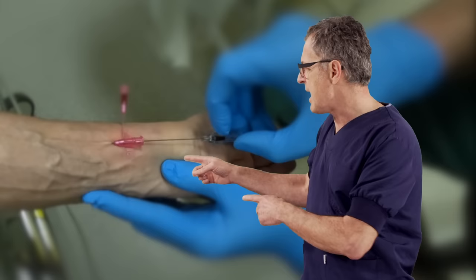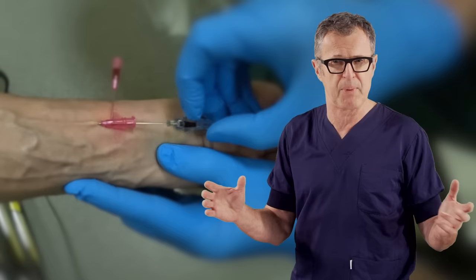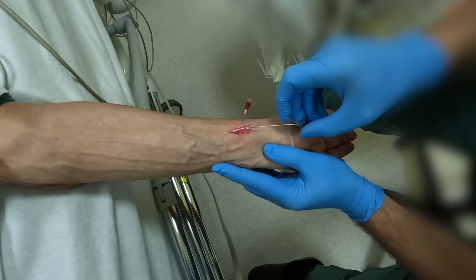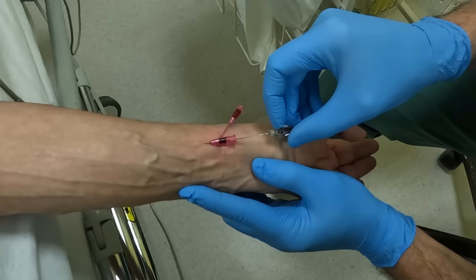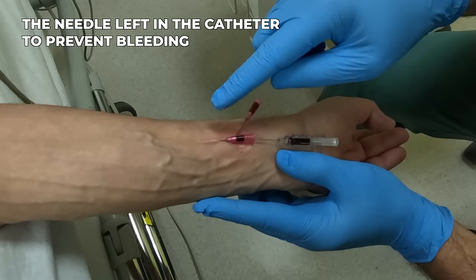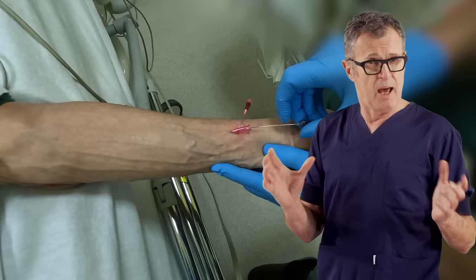Notice how the catheter here had to be pulled slightly back, because its tip was inserted up against the next tributary network, which obstructed the needle tip. Pulling the catheter 2–3 mm back was all that was necessary to make it work. Based on this, you can see that the first practitioner went through the vein, but because the tip could not be lifted up, it went underneath the vein — a common mistake. Again, we needed to pull the IV catheter slightly back to distance its tip from the next venous junction.